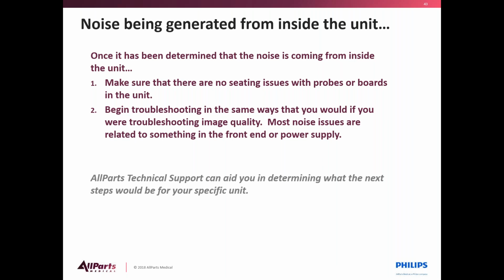Number two would be begin troubleshooting in the same way that you would if you were troubleshooting an image quality issue. Most noise issues are related to something in the front end or in the power supply. And at this point, you may need some help, and our AllParts technical support can aid you in determining what the next steps would be for your specific situation.